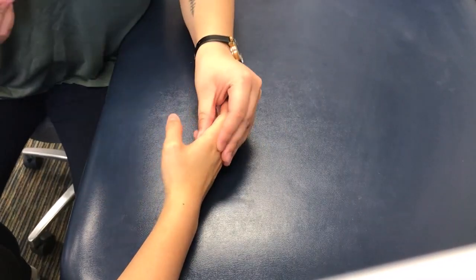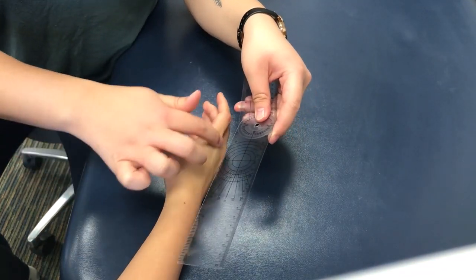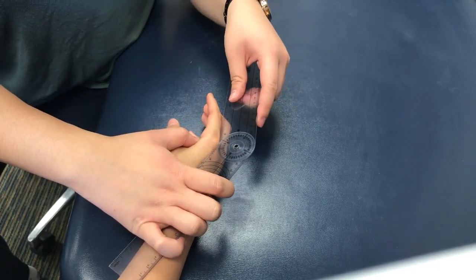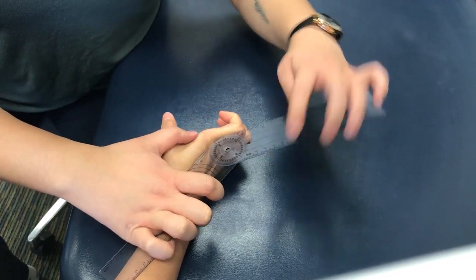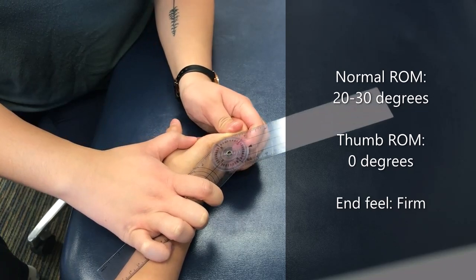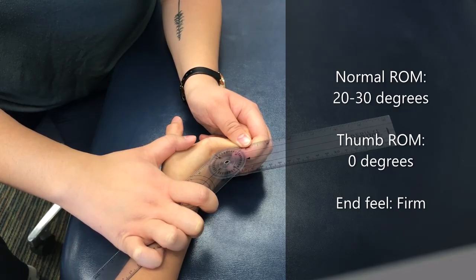So to get MCP finger extension, the axis will go on the dorsal side of your MCP joint, and the proximal arm will go parallel to the metacarpal, and then the distal arm is going to follow the dorsal side of the proximal phalanx. So go ahead and extend your fingers like this. So for active range of motion, it's 34, and then for passive range, I'm going to push you into end range. Oops, sorry. And it's 42.